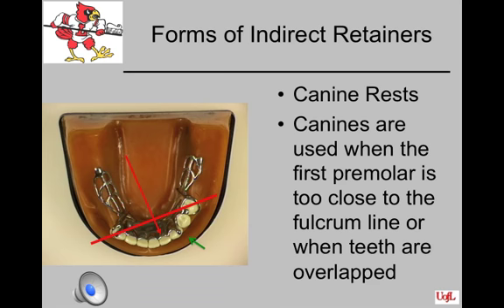The first premolar is the desired location because occlusion is not usually a factor and it is more aesthetic. An incisal rest on the canine, or an acid etch composite cingulum rest, may be used on mandibular canines. We do not normally cut a cingulum rest into the lingual of the mandibular canine, as the enamel is very thin in that area and a naturally developed cingulum usually is not present. The incisal rest may be used if the patient does not have a problem with aesthetics. Acid etch cingulum rests must be properly executed or they will not hold up. The mesial rest of the first premolar should be considered because of all of its advantages.